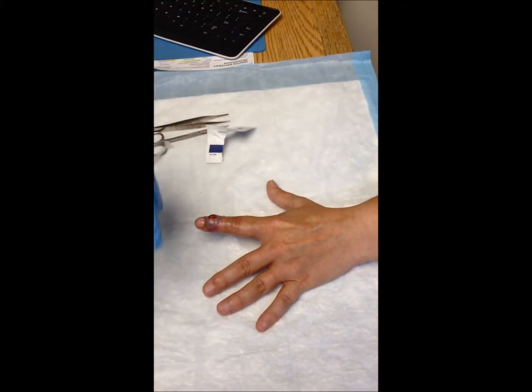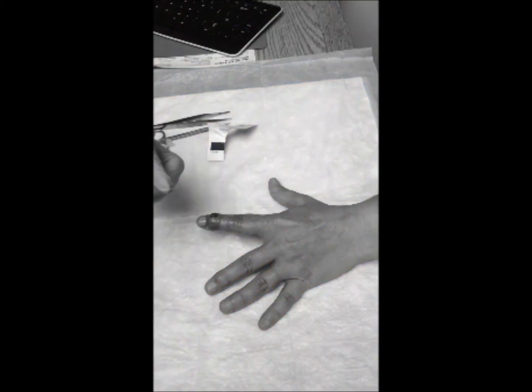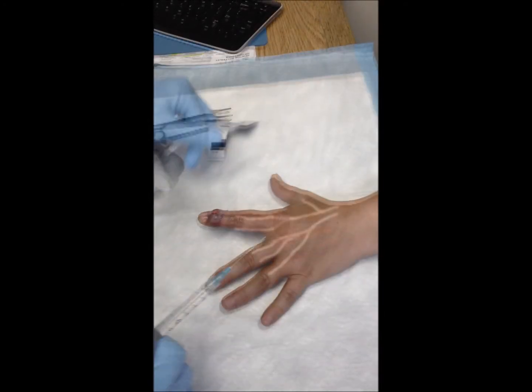The dorsal surface of the finger is being prepped with alcohol, and the dorsal sensory nerves are first blocked. These are outlined here — they are actually branches of the superficial radial nerve in the index finger — and the oval marks the spot where we will raise a bubble of anesthesia.